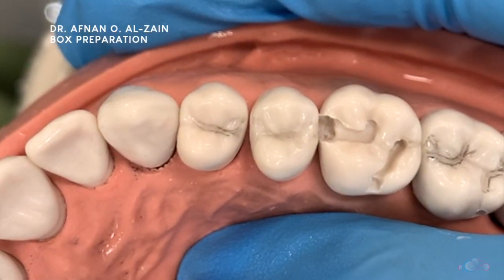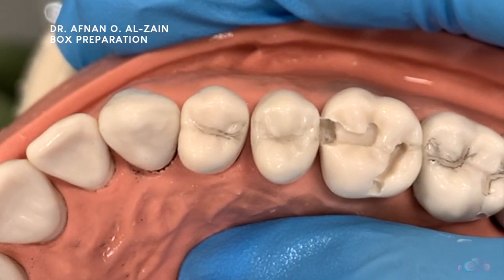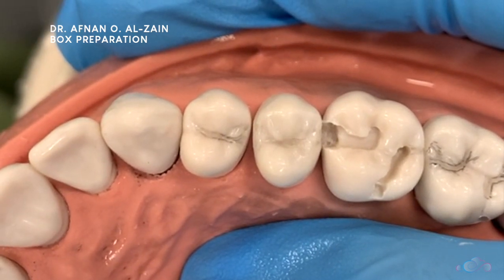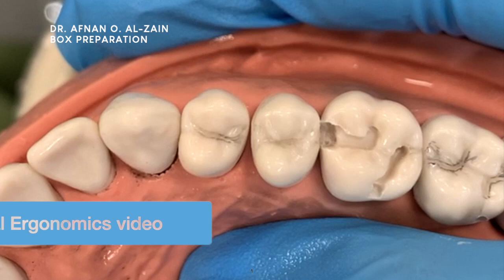Hello everyone, how are you? In this video, I will show you how to do a box cavity preparation on an upper premolar.